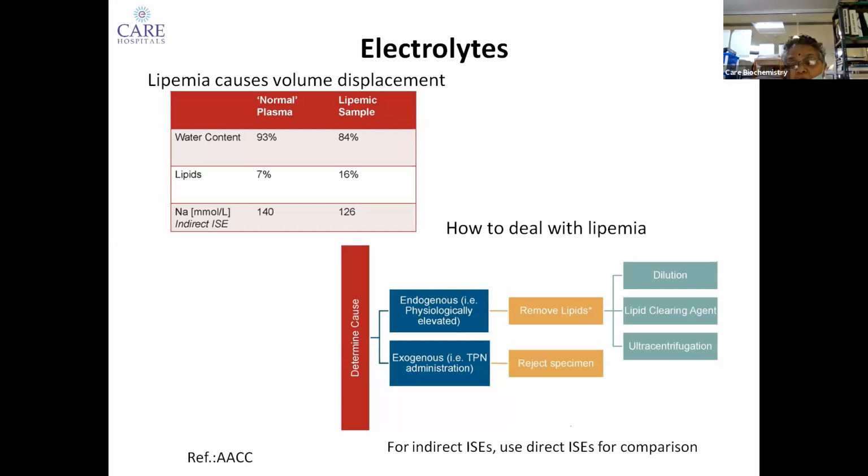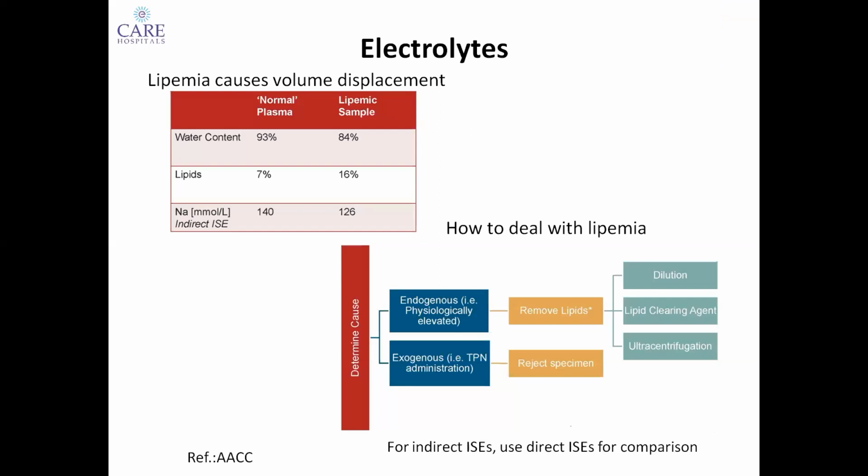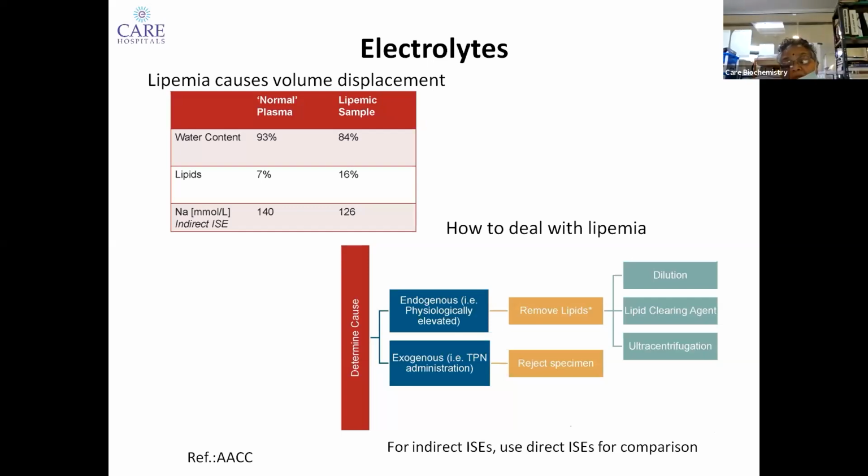Each lab, we just cannot go by all what other labs have done. Each lab's platform is different. Each lab's measuring capacity is different. The measurable range, the intensity, etc. So it is always better to have your own lab data. Yes, literature is our guideline. Our peers are our guidelines. We can always approach them. We are always not perfect. We don't know everything. By talking to each other, we can always come to a conclusion and help each other. In the final run, we are helping the patient.